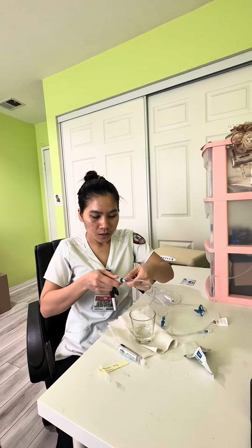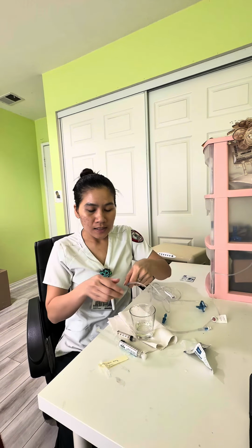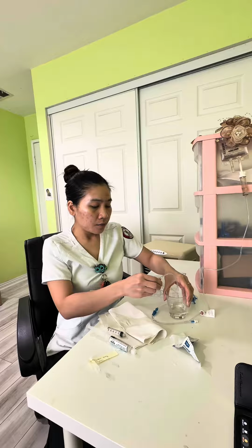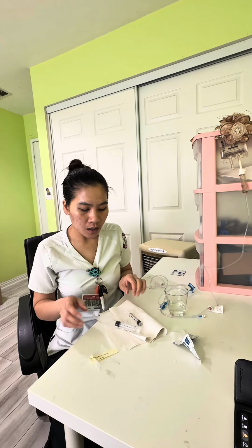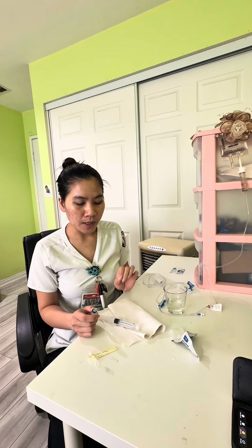So after finishing administering the patient medication, I assess again for the IV site and for signs of redness or swelling. If the patient doesn't have any sign of redness, swelling, or discomfort, I go ahead and clean my area. I put the syringe in the sharps container. Also I document how the patient tolerated the medication, what site of IV I gave the medication in, what medication, what doses, and what time I gave the medication.